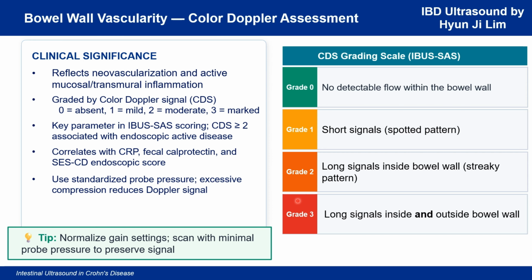From a technical perspective, standardization of probe pressure is crucial. Excessive transducer compression can reduce detectable Doppler flow and result in a false negative interpretation. Therefore, examination should be performed with a gentle probe pressure, optimized gain setting, and a consistent scanning technique.